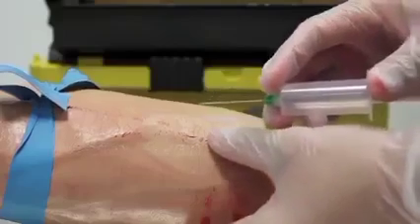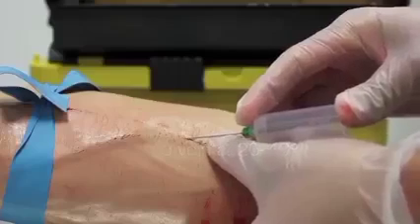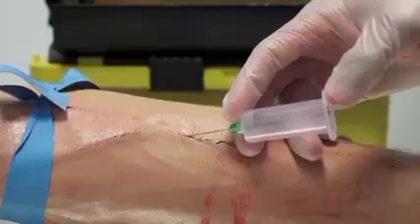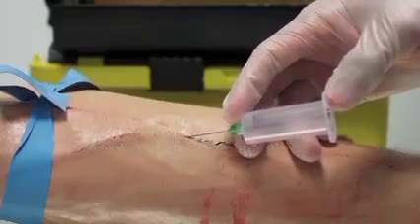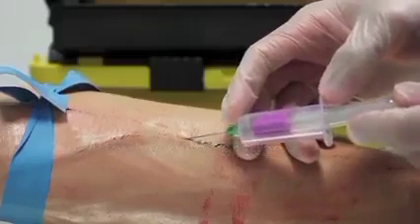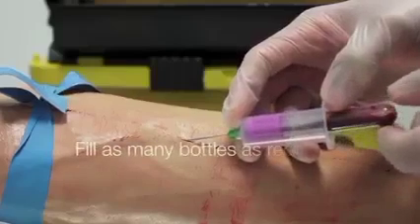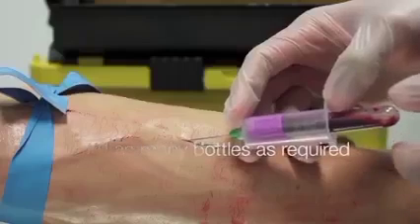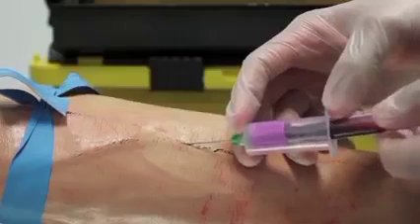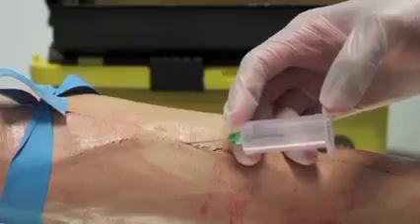Secure the vein that you want to take the blood from and insert the needle at 20 to 40 degrees in the direction of the vein. You should feel a slight give as it goes into the vein. Then secure the barrel to the skin so that you're not moving it as you put the vacutainer on. Fill as many vacutainers as you need to with blood, again fixing the barrel to the skin each time you remove or replace the vacutainer.